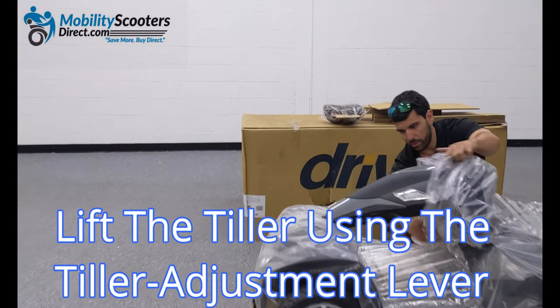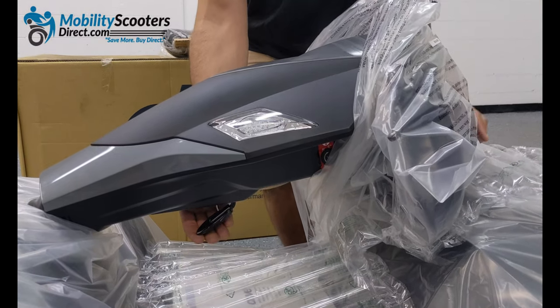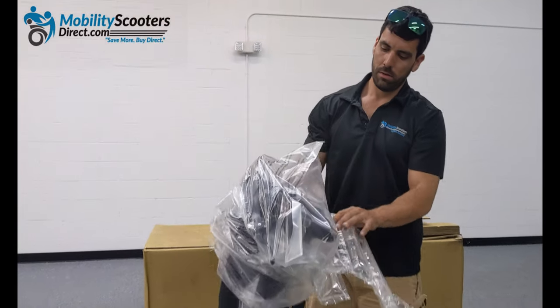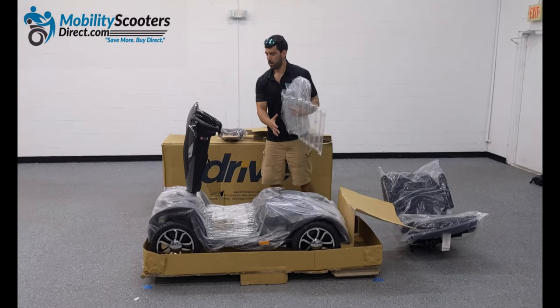Next you'll want to lift the tiller by locating the tiller adjustment lever, which is underneath the base of the tiller. Press it in and lift the tiller straight up so that you can access the rest of the components inside the packaging. You can go ahead and remove the plastic wrapping and the bubble wrap from the tiller.